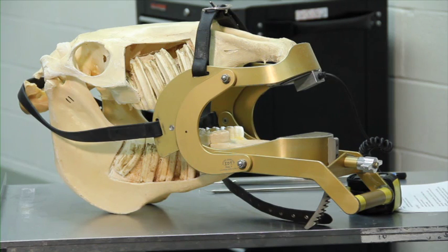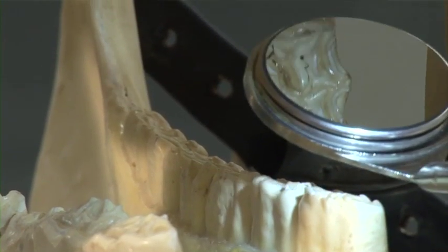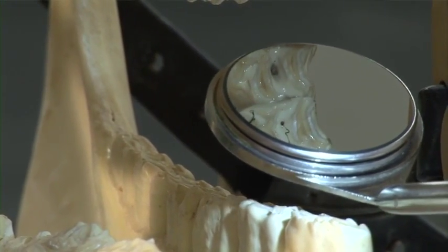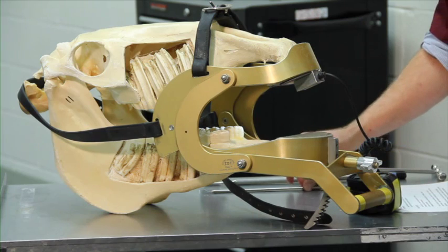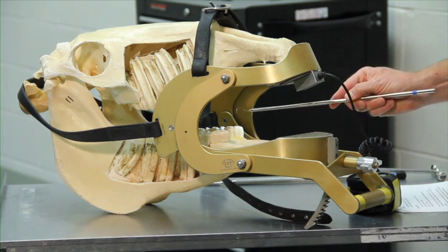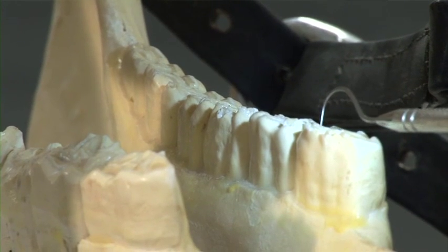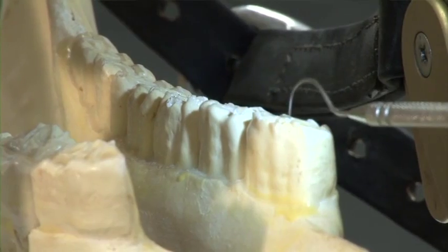The dental speculum allows the mouth to be propped open safely and allows a hand or instruments to be safely passed into the mouth. Frequently, as part of the exam, veterinarians will use a dental mirror to examine the chewing surface of the cheek teeth. If there are areas of the crown that appear damaged or decayed, instruments like a dental explorer can be passed to check areas of the crown that appear diseased.